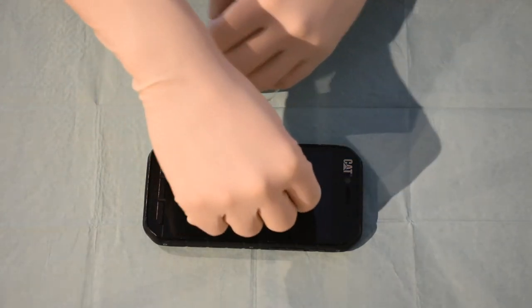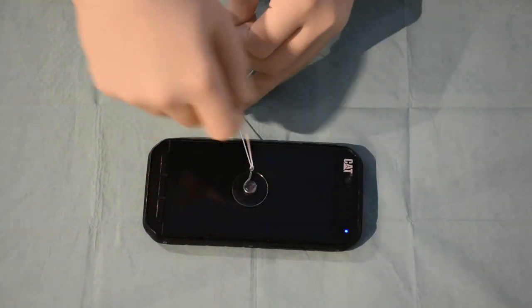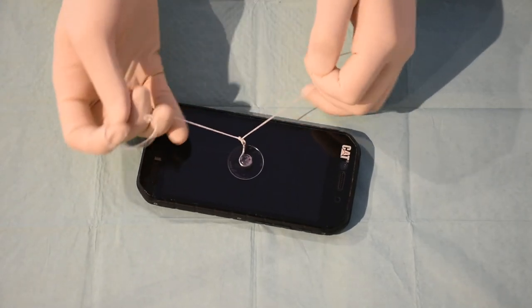All you have to do now is pull it tight like this, and then finish it with the claw so it makes a full knot.